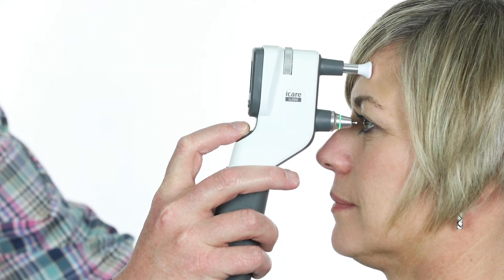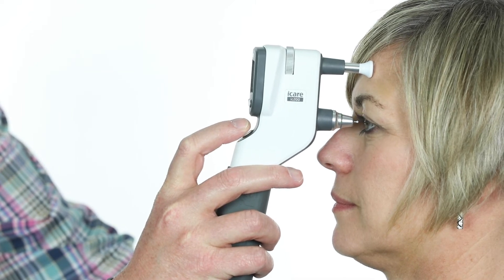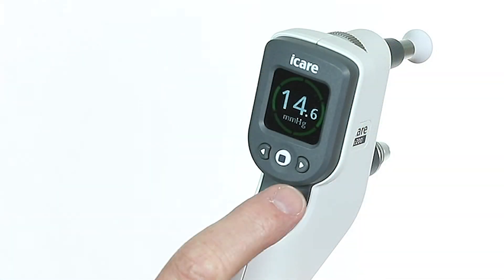Press and hold the measure button to take measurements automatically. You will hear a long beep and the final pressure will be displayed.